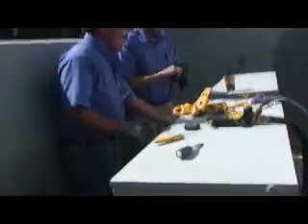There's also inside the unit a sight glass, and there's a clear plate. This plate is see-through. You can see the level of your glycol in the machine here. It's always yellow. You can see that this one is full right now, but if it's low, you'll be able to see the yellow is low, and you would want to add the correct coolant to the machine: the yellow dye 50-50 glycol with deionized water. You can see right here it tells you the 407C refrigerant for the machine.